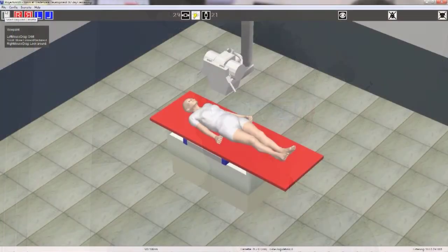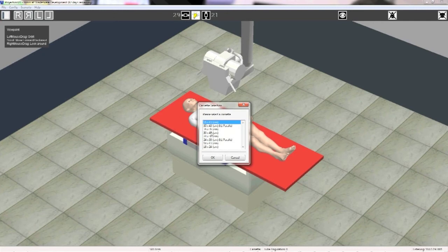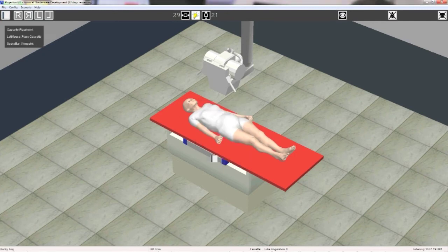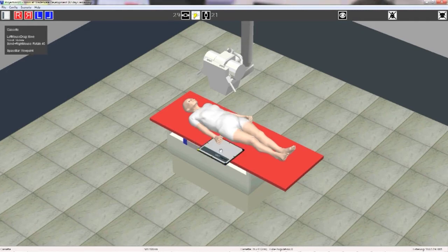As you can see from the pictures, the students are happy with both classes and they get different outcomes from each. They're not duplicating. In Projection VR, they focus on the terminology of equipment, positioning and projection. They learn the radiographic science they would have done by exposing phantoms in a live room. In fact, the module leader reports that several of the traditional lectures have actually been dropped, saving even more staff time, as the content is now practically covered within Projection VR sessions.